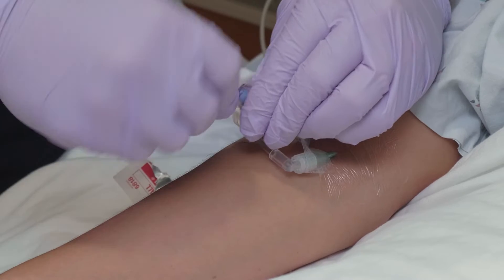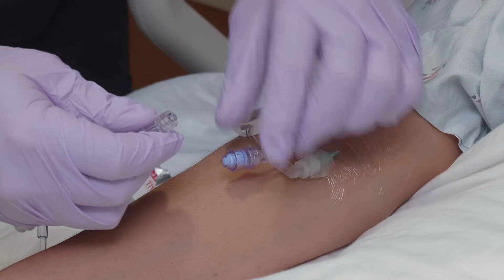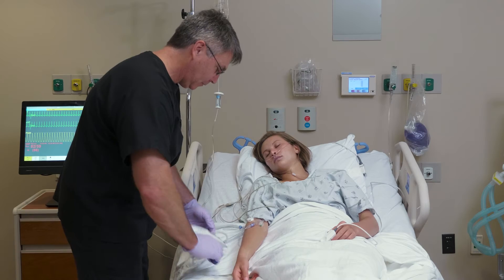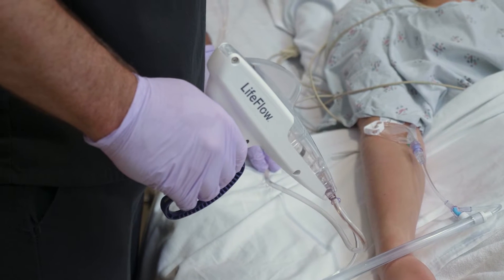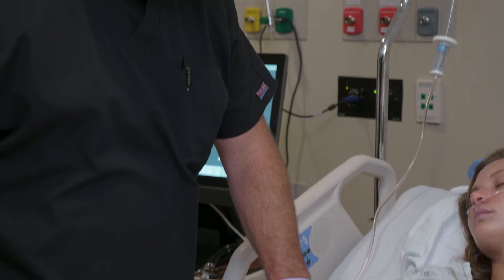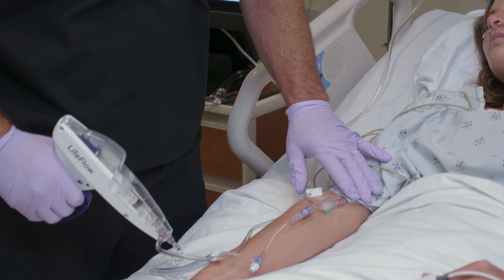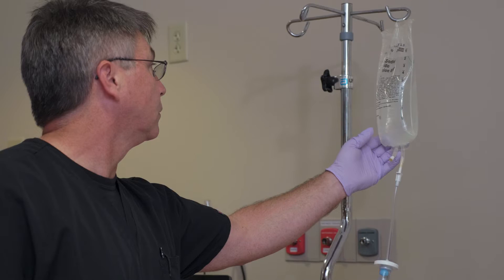Using standard aseptic technique, attach the LifeFlow wide tubing to the patient's IV access. Begin to infuse fluid by squeezing the handle. Each stroke delivers 10 milliliters, and total volume delivered can be calculated by counting the number of strokes or by noting the total volume of fluid remaining in the bag.